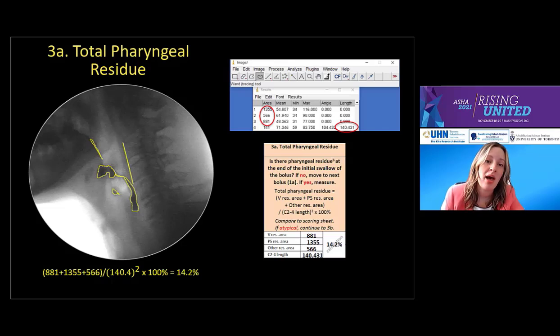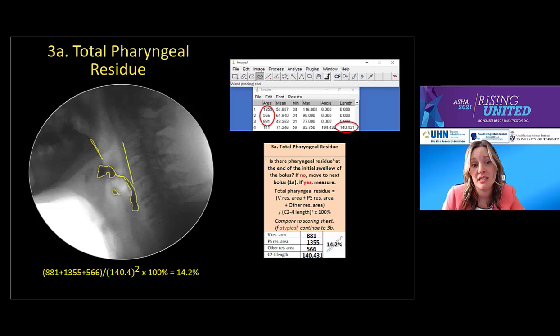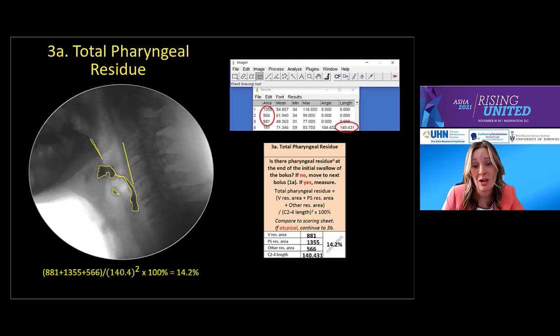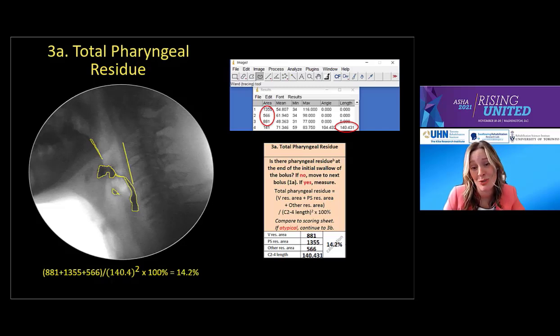You might think it would be easy to tell that residue fills more than 1.5% of the C2–C4 squared space just by looking at it. However, there are still several reasons to measure. In this patient's case, we went on and performed 12 weeks of dysphagia treatment. Even post-treatment, this patient still had a lot of residue. In such a case, having numbers pre- and post-treatment makes comparisons really easy and removes any bias we have as clinicians performing post-treatment exams, where we are often hoping our patients will improve.